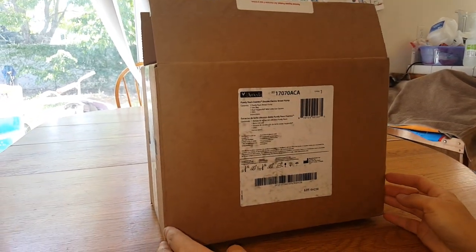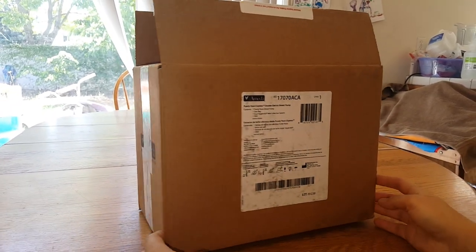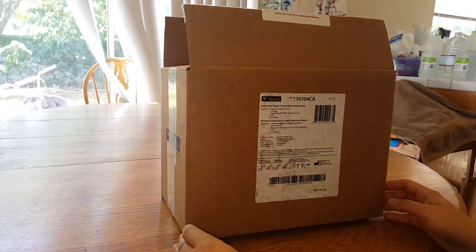So as you can see, it comes in like an 8.5 by 11 by 6 inch box, not too big.